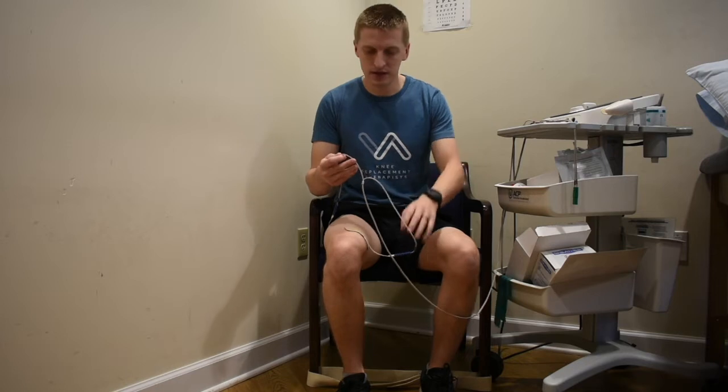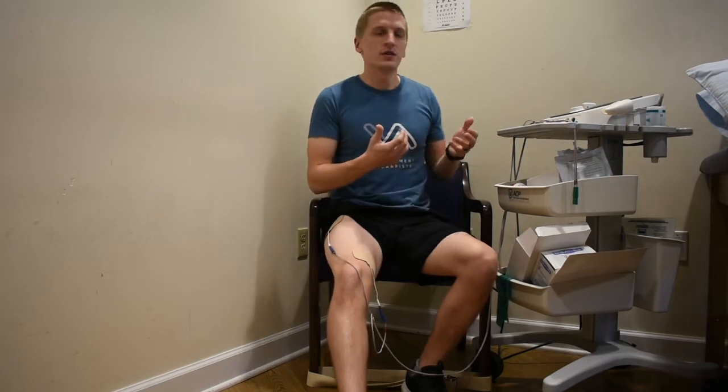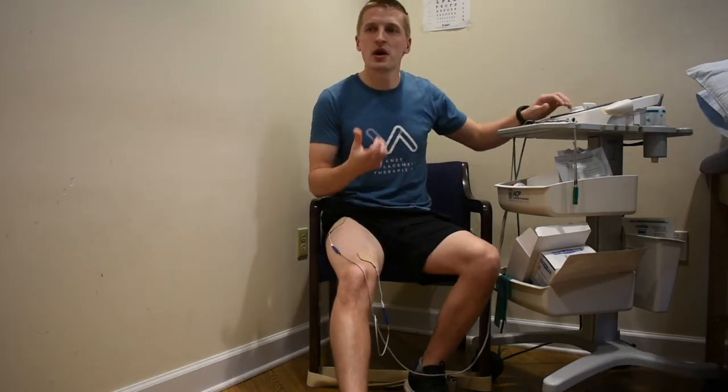Take one of the leads or channels from the unit, connect the wires to the pads, and make sure everything is connected to the machine. Then turn on your machine, go to the NMES setting, and turn up the intensity — the milliamps — to get to the strongest contraction you can tolerate.